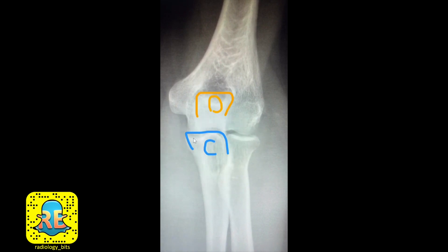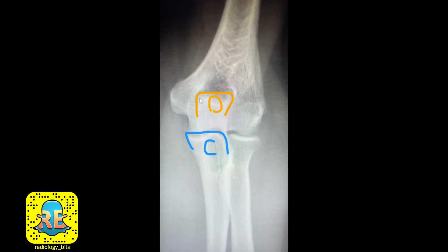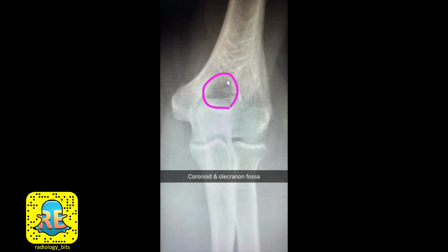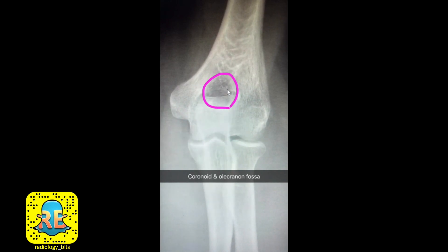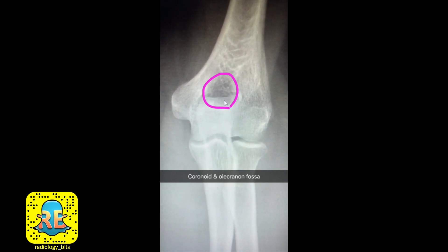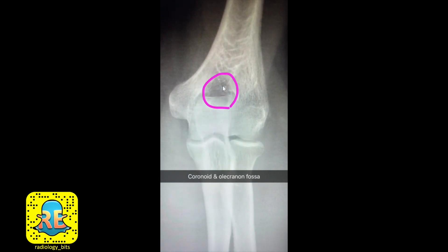The proximal ulna has a more anterior projection called the coronoid process, while it has a more posterior projection — seen on top of the humerus — called the olecranon. Notice there's an area that looks darker or lucent compared to the rest of the bone. This part of the distal humerus is lucent because there is an anterior and posterior groove or fossa. The anterior fossa fits the coronoid process — the coronoid fossa — and the posterior fossa fits the olecranon — the olecranon fossa. They'll be easier to see on the lateral projection.